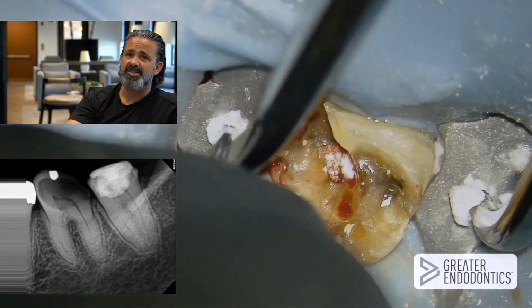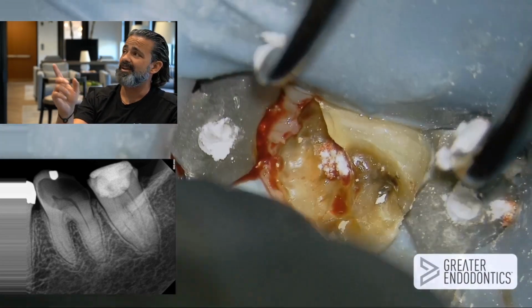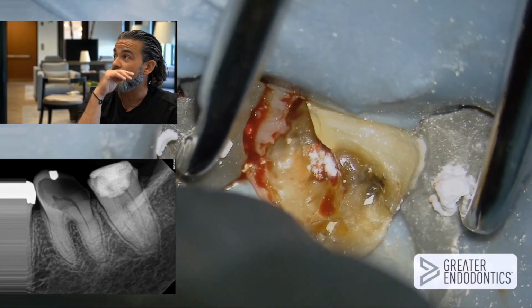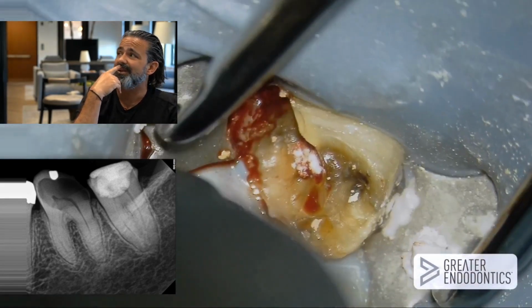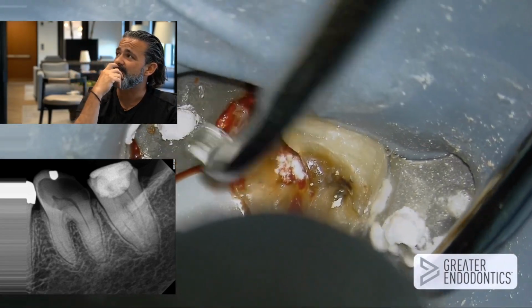Like if I just touch it, even if I think ahead a few steps that I've got to get a platform on there, it's gonna pop off. And it really does need a version of crown lengthening. And so I'm going, dang it, I need stability for this procedure to work. And so it comes to a point where, yeah, I can remove the decay. I see what's left. I blocked myself out of the pulp space, and I'll show you why.